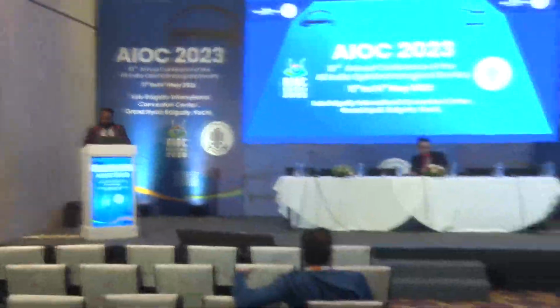Wonderful talk, Nivian, as usual. Lovely videos. I think the important message you have given is the vertical chopping with a sharp chopper, very important. Bury the tip, expose the tip, create a good vacuum seal, and go vertically down. Normally in divide and conquer, you go parallel to the capsulorhexis margin. Here you need to go vertically down so that you are inside the nucleus nicely, and then you can chop, making sure that you separate the posterior nuclear plate. And all the pearls have been beautifully enumerated.